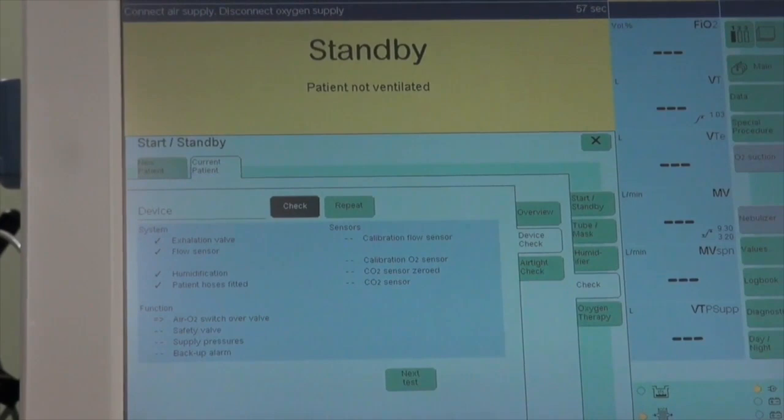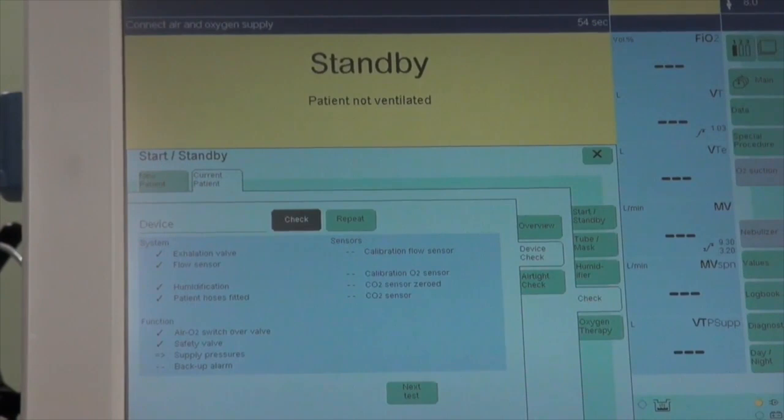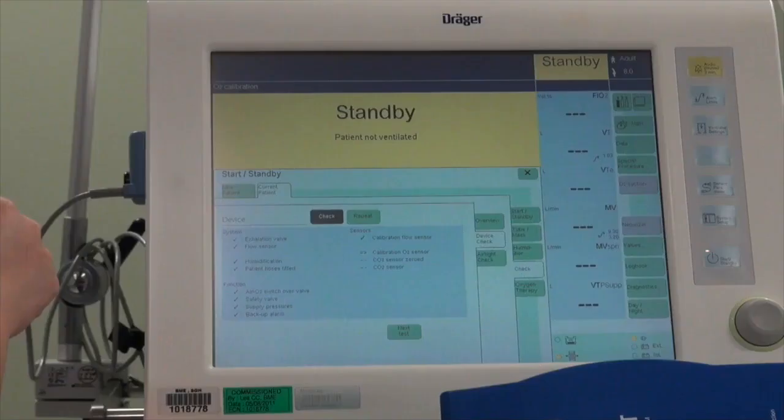Connect air supply, then disconnect oxygen, then connect oxygen, then disconnect air supply, and finally connect air and oxygen supply. Next, confirm the audible sound alarm with Yes.